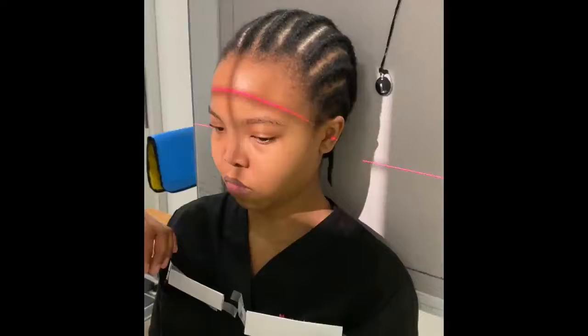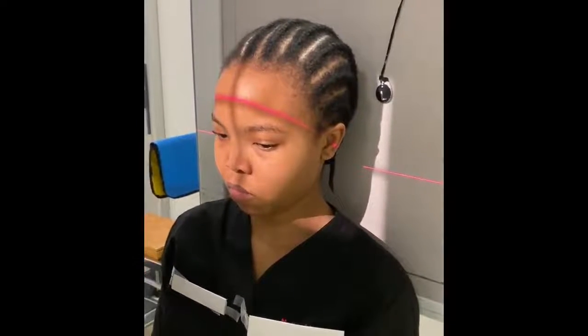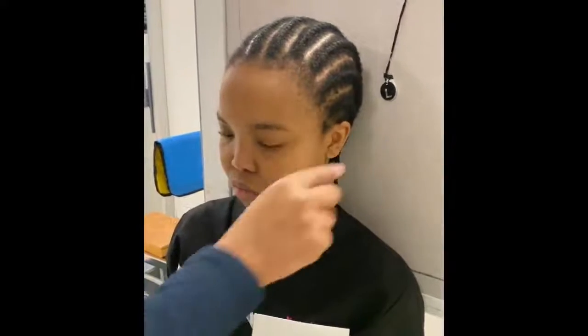If we are doing a 37-degree angle where the patient cannot tuck their chin in, then we use your IOML. So your IOML then needs to be perpendicular to the image receptor.